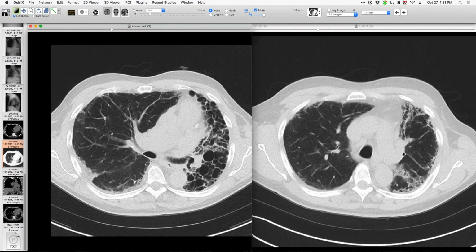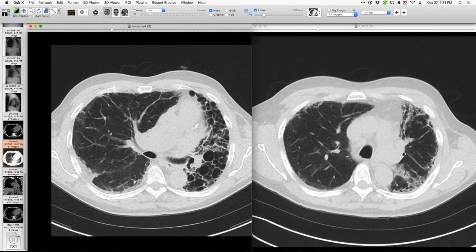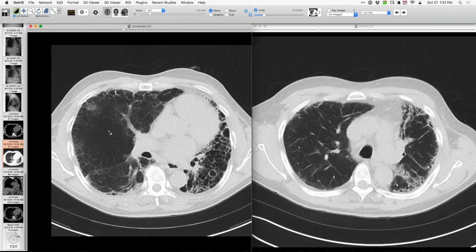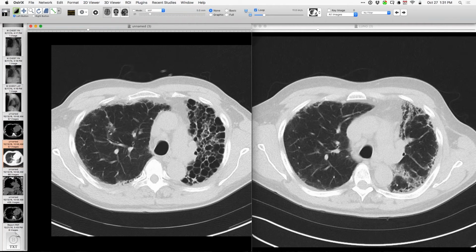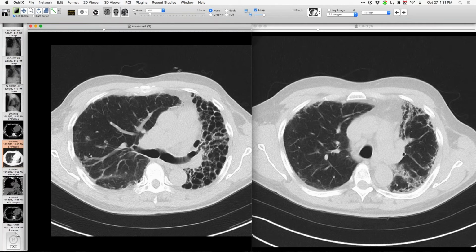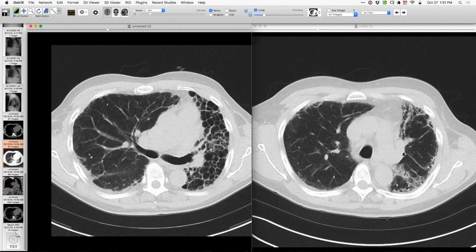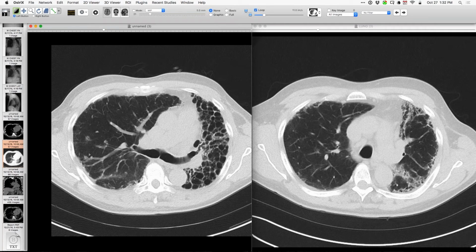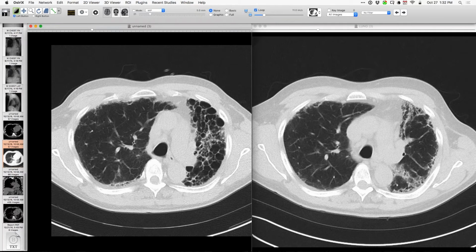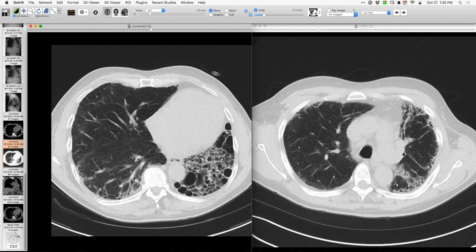And I've certainly seen a couple cases before of asymmetric fibrosis, perhaps not as dramatic as this one, and how much lung parenchymal loss occurred on the left side, but I thought this was really impressive. There are descriptions of asymmetrically severe IPF, and we presume that this is what it is, but this one is very dramatic. Have you ever seen one quite as severe as this, Travis or David? This progression, but this severe in terms of progression over that period of time? That's pretty impressive. Yeah, just very, very impressive.